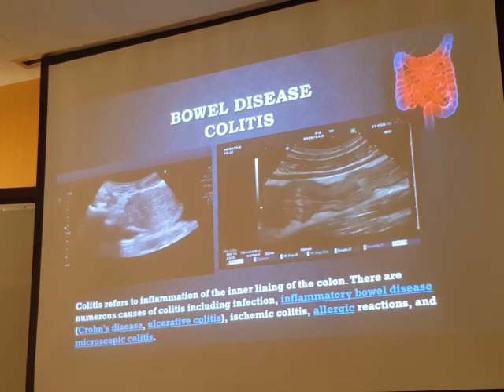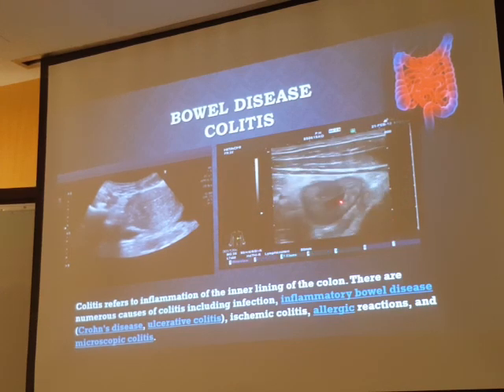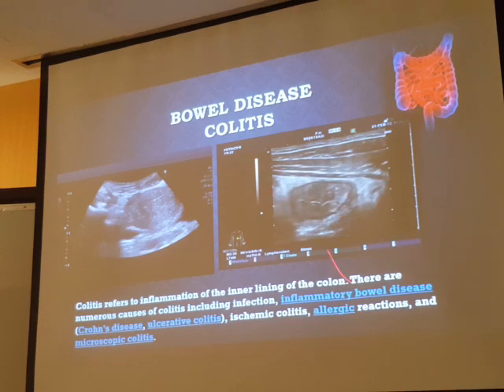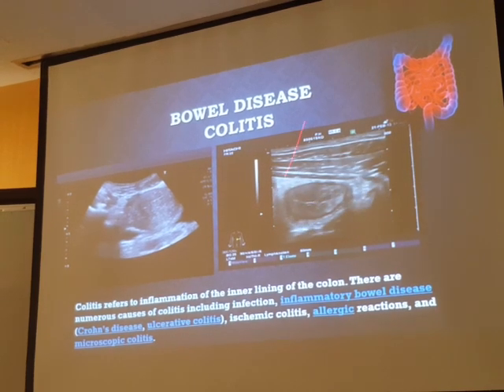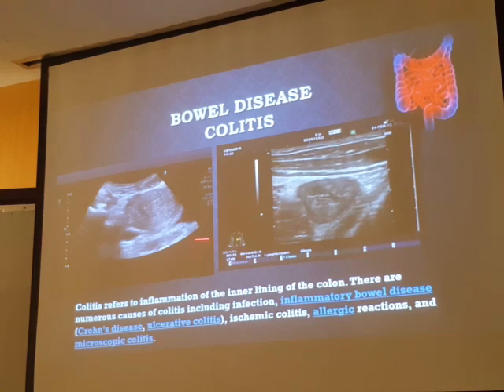As I say here, see this bowel infected, the echogenicity. So what is it here? Who can tell me, what's the sign here? Increased movement, peristalsis. Yes, peristalsis, very active movement. Yes, there is fat surrounding it. There is thickness. Is there any gut signature? No, it's totally different. Echogenic, thick layer. This is how colitis looks.